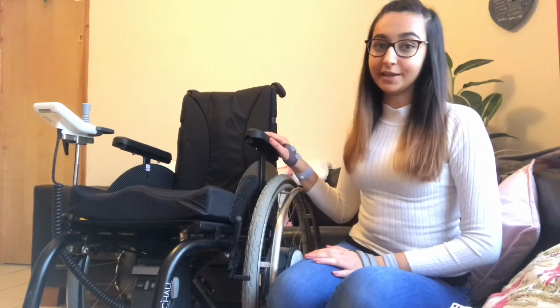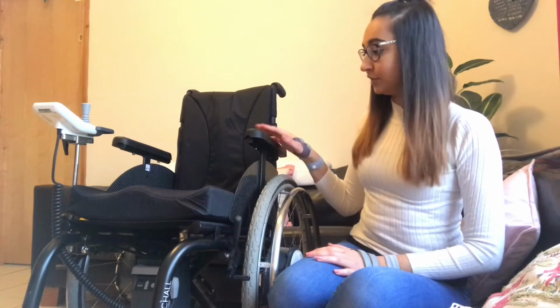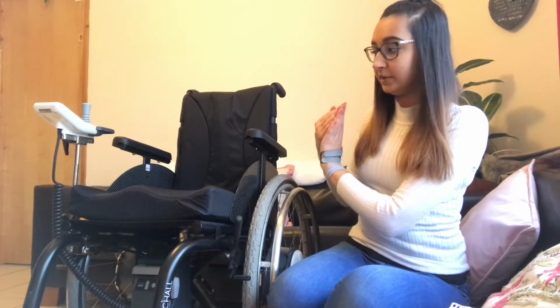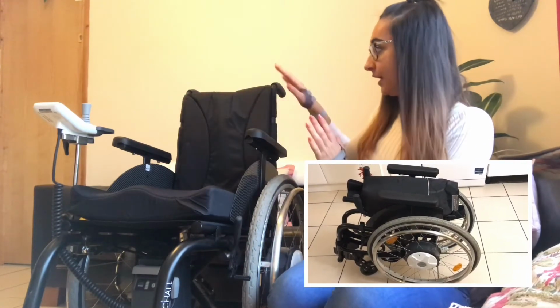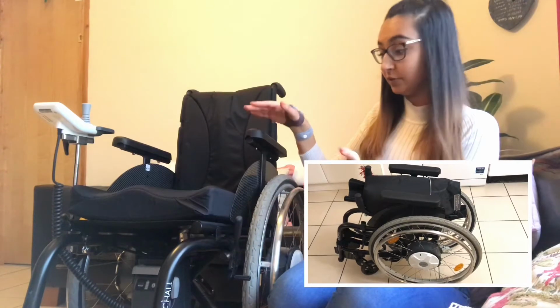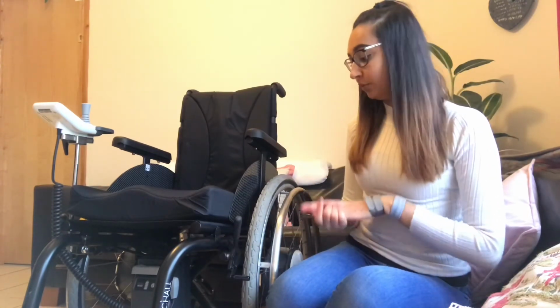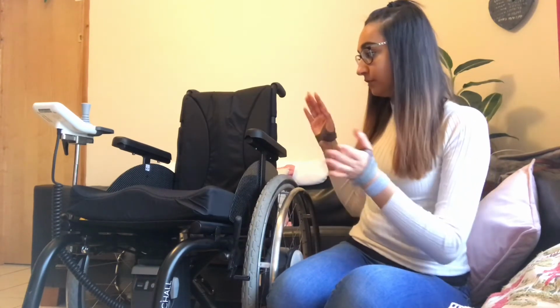So as I was saying, this is the Kuschall ultralight chair. It's a folding chair, which means it folds inwards. I might get a friend to help me insert a clip of that if they can help me. So it folds this way, and then the back folds down as well. So that means it can fit in cars really well. And actually that was a problem with my other chair. This one is much easier for me to go out with my friends because it folds.